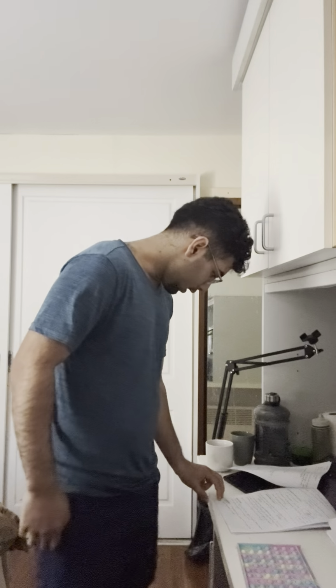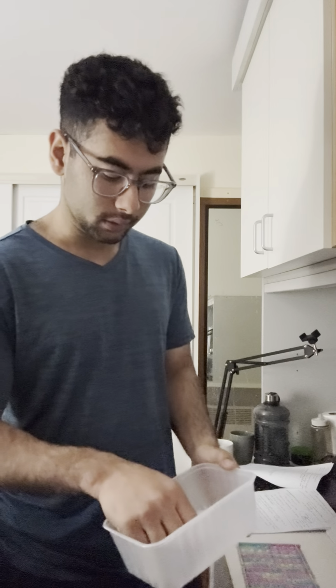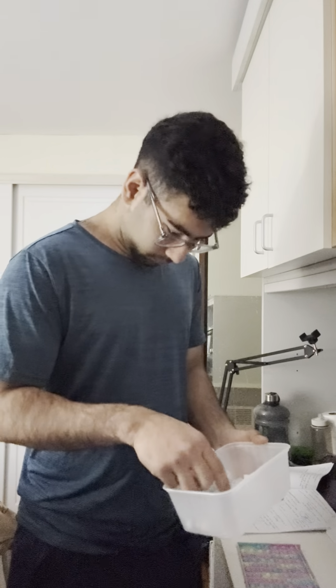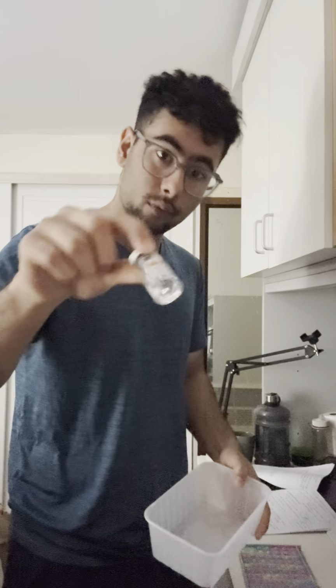As I see here, I don't have the SSI chart, which is the insulin subcutaneous chart, but I do have this chart. So these are the two things that I need for this moment. And now bring your PPE, like your gloves, do your hand hygiene, bring your stuff. Normally for subcutaneous insulin we use an insulin syringe, but for now, for example, this is the Novorapid, as you can see, right? This is what I'm giving, and I'm giving 4 units.